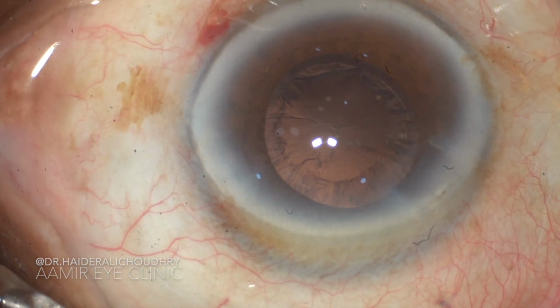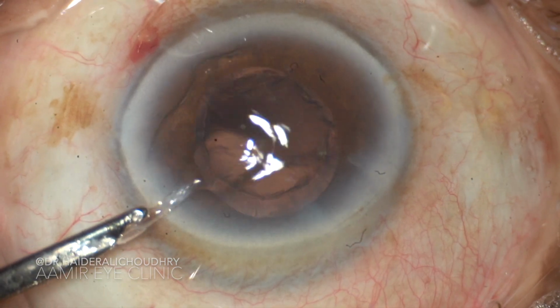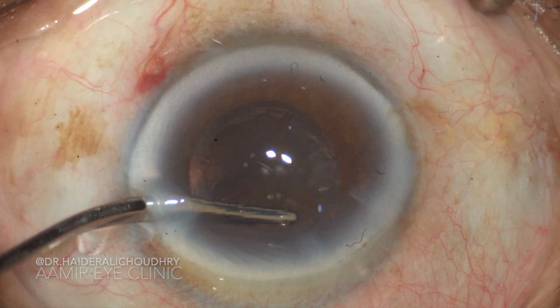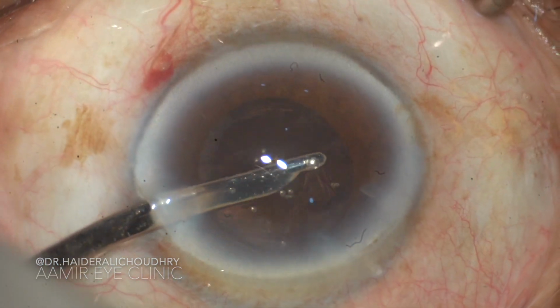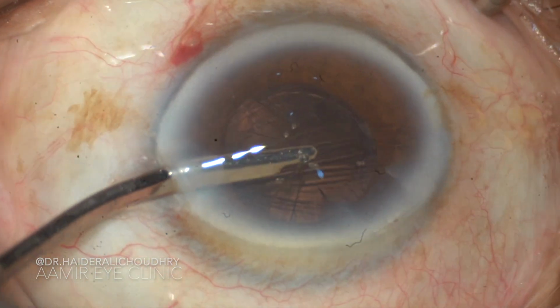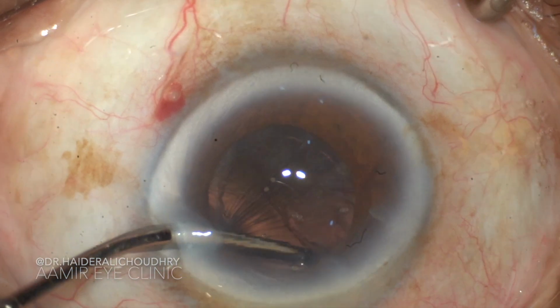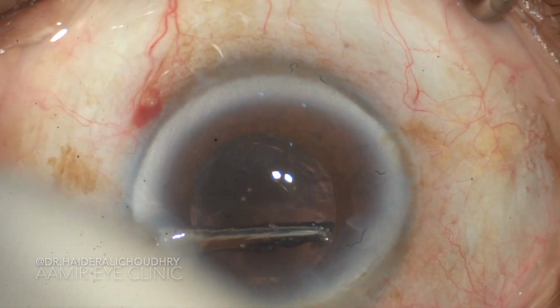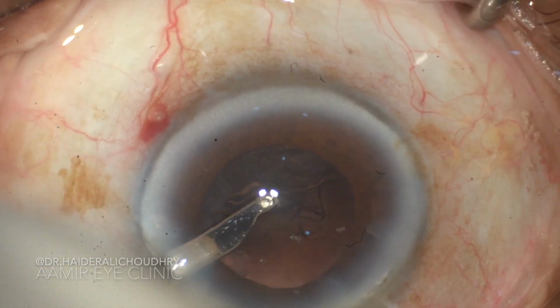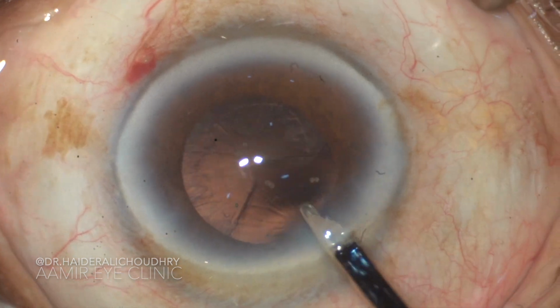We are using a Simcoe cannula to aspirate the remaining cortical lens matter. We are starting in the subincisional space. I find it most efficient to get the subincisional cortex first because that is the most tricky one, and you have an adequate cushion of the remaining cortical matter to protect the posterior capsule.